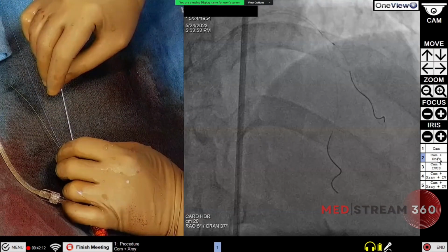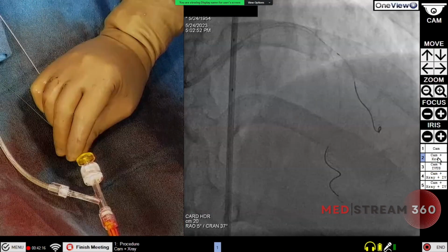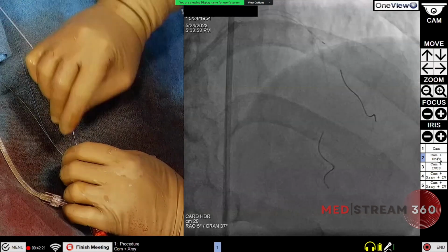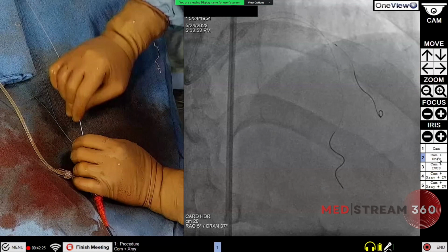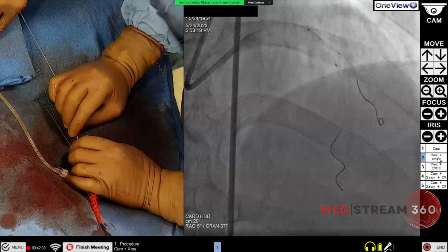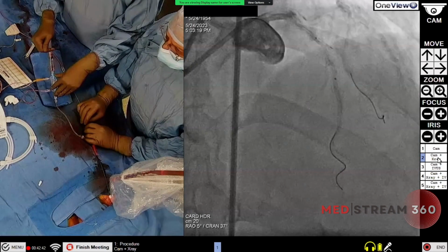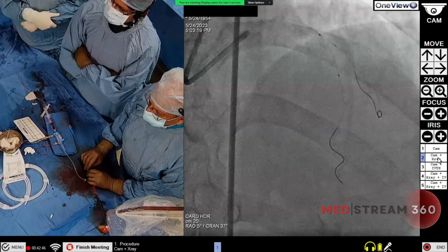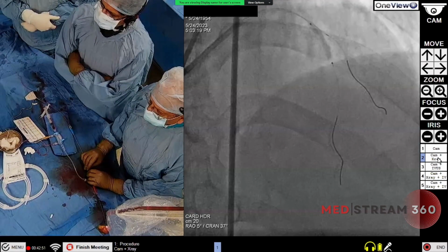Okay. So I'm taking this balloon here. So this is one of the best, I must say, at this time, technology-wise, balloons, which is the solution balloon. Go one, two, go forward. Shall we go a little bit more? Yeah, more. We can go. Why not? Check, please. Yeah, that's fine. That's good. Okay, 1, 2, 3, 4.